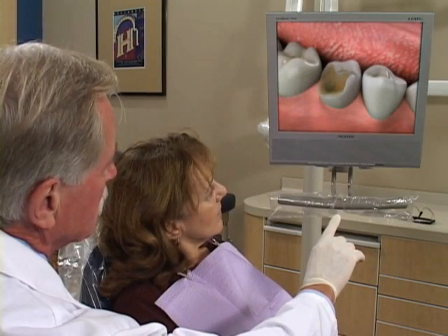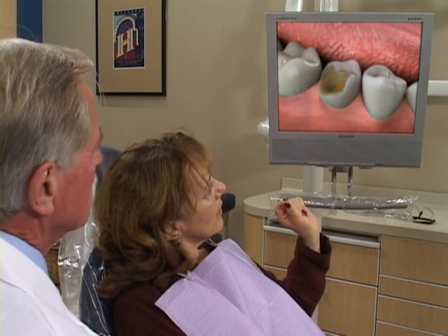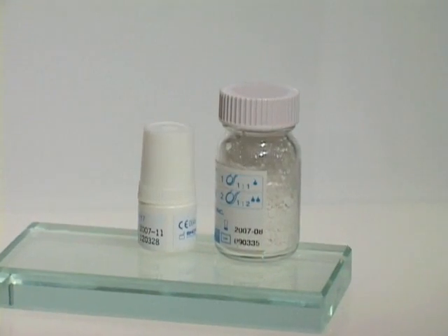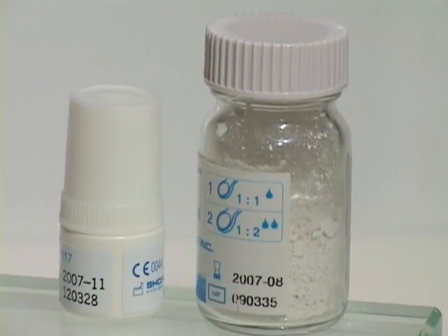We use a core buildup to replace the missing portion of a severely broken down tooth prior to placing a crown. The material we use most commonly is a composite resin that is bonded to the tooth.